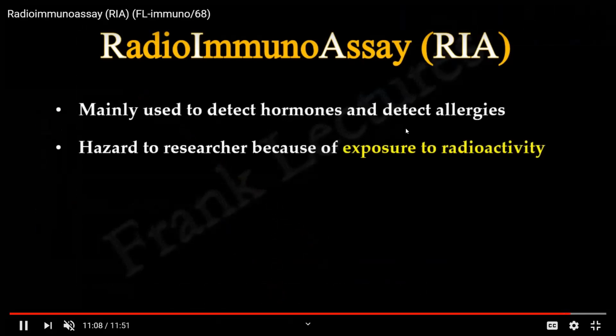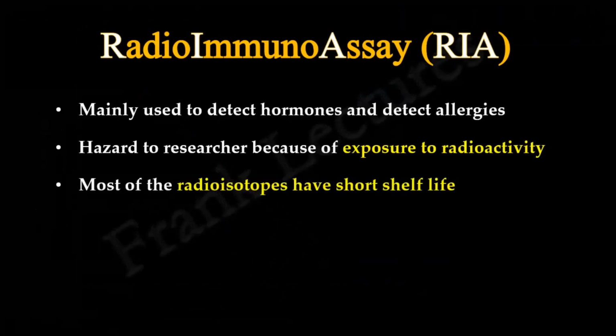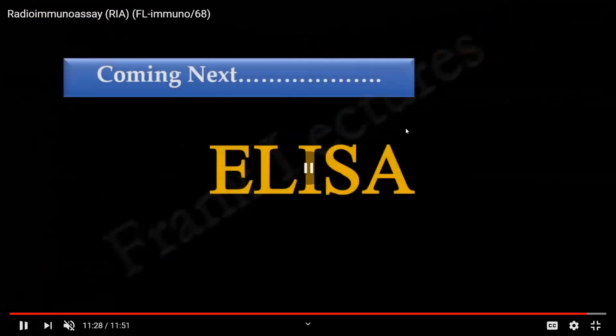The demerit of using it is that the people who work on this are exposed to radioactivity, and so that is a bit hazardous for those persons. Most of the radioisotopes have a short shelf life, and the instruments used for this technique are very expensive. It's a time-consuming method.